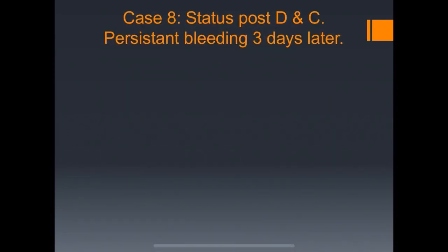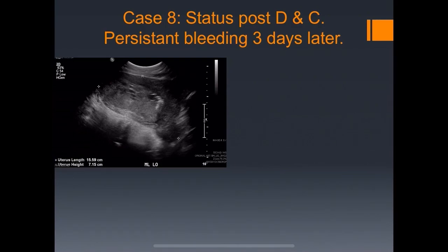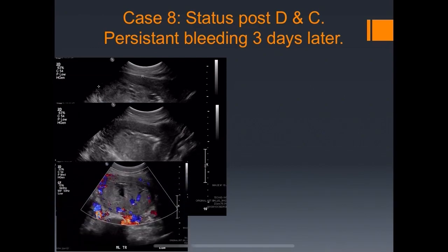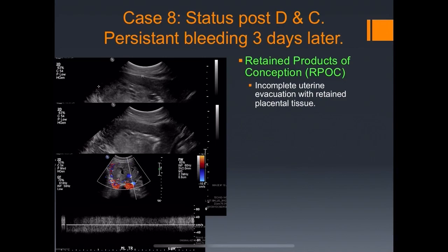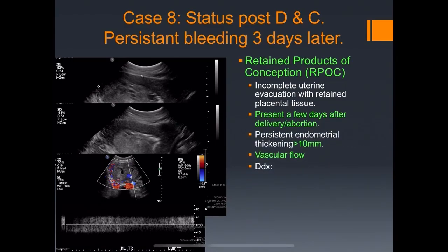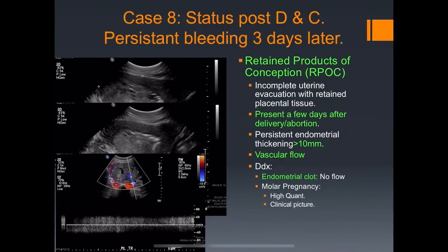Status post-DNC with persistent bleeding three days later: sagittal view shows a thickened endometrium with color flow and high velocities — consistent with retained products of conception. This represents incomplete uterine evacuation with retained placental tissue, presenting days after delivery or abortion. You want to differentiate this from a normal endometrial clot, which usually has no flow. Occasionally retained products can have no flow but that's relatively rare. Differentiate also from molar pregnancy — which has a sky-high quant and different clinical picture — and from AVM, which tends to be myometrial in location.